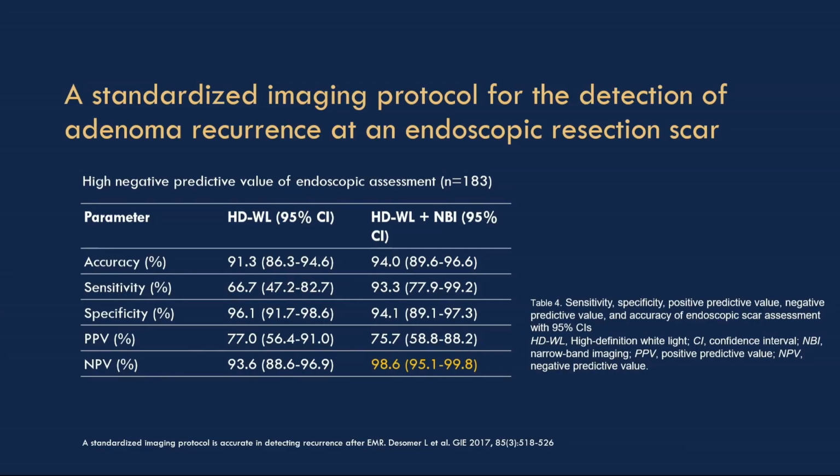So indeed, we have published a standardized imaging protocol for detection of adenoma recurrence, and we can achieve a very high negative predictive value if we combine both high-definition white light and NBI, if we apply both to the scar.